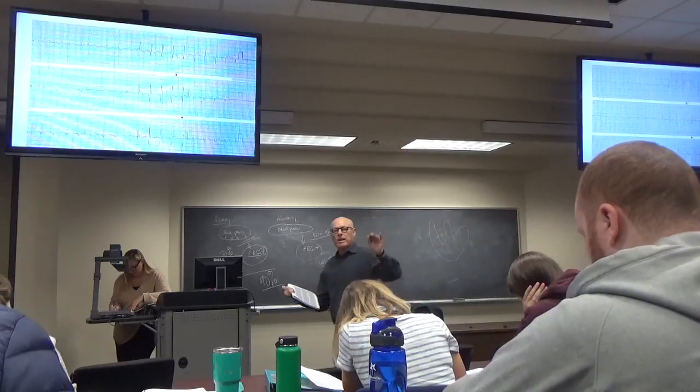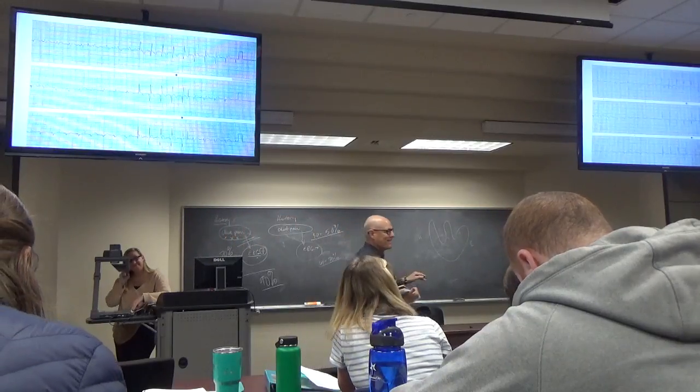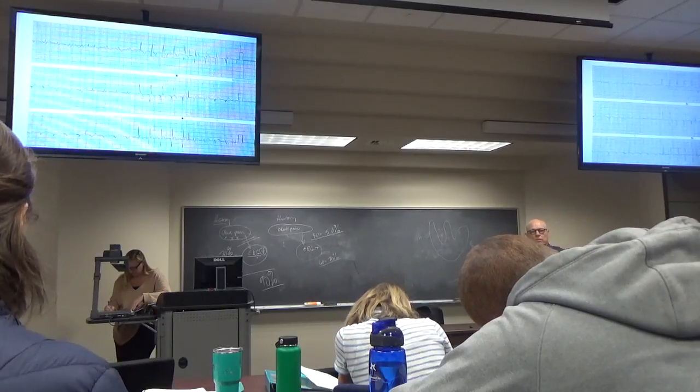But I'm not likely to put anterolateral septal infarct on a test. In fact, I will not. If I say anterolateral, it's in the anterior leads and in at least one or two of the lateral leads, okay?